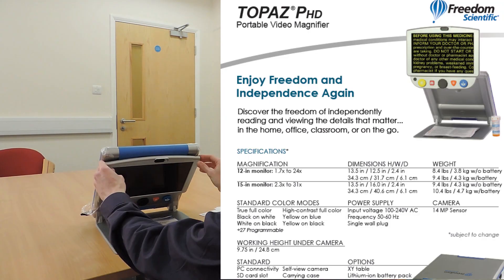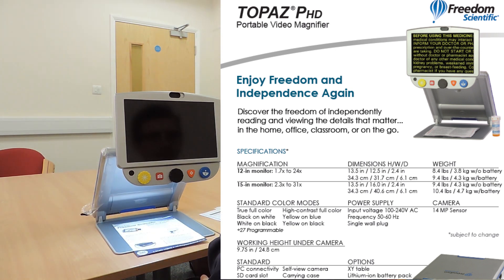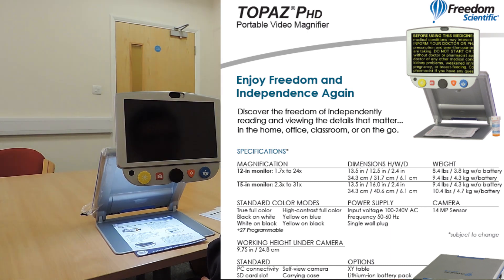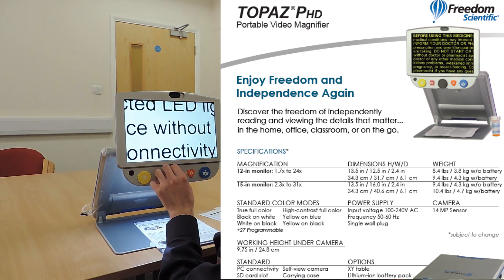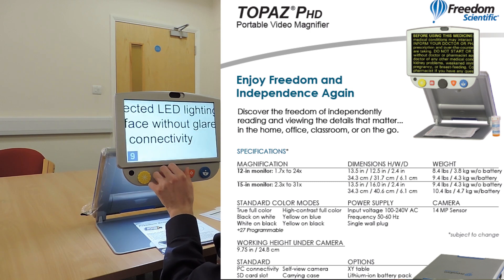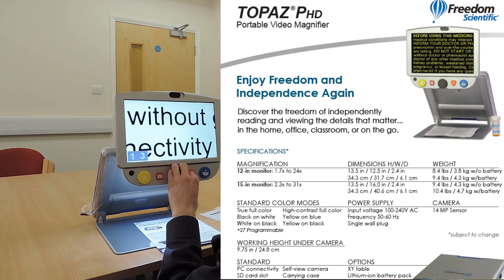There are six default colour modes and 27 customisable colour modes. A freeze frame feature captures the current image on screen. A find function briefly zooms out to easily locate the centre of the object displayed. Adjustable reference lines and masks emphasise an area on screen. An SD card slot lets you capture and save images, a USB port provides connectivity to a computer using GEM software, and a self-view camera on the front offers magnification up to 2.5 times.